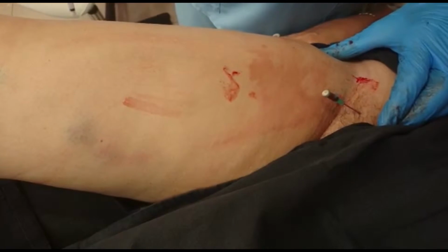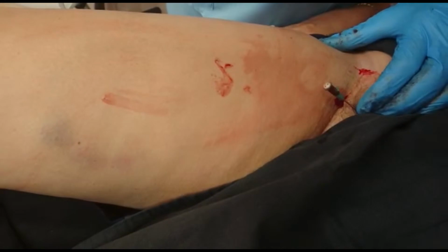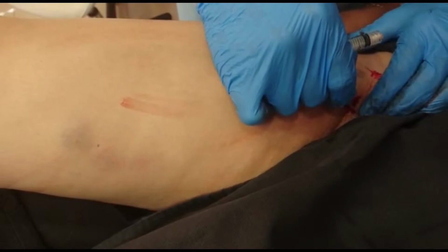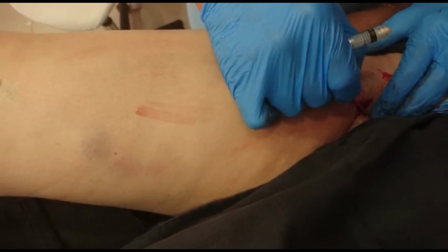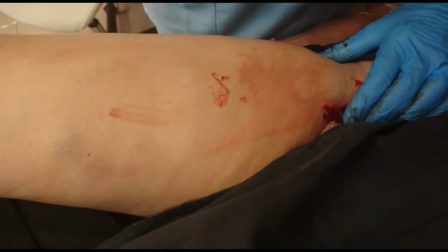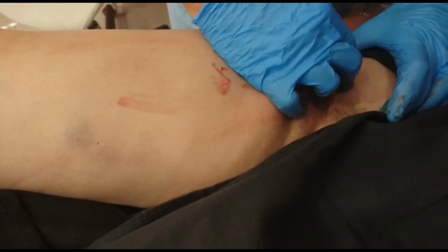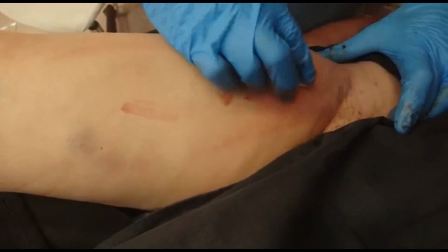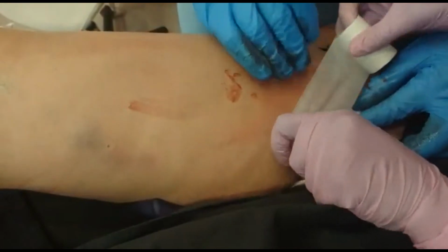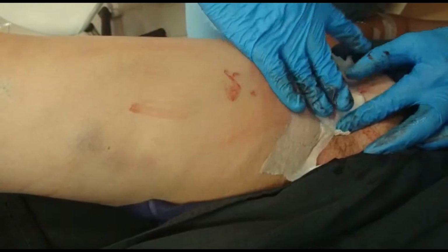If we look now, we'll see that there's a little bit of backflow, but it's definitely decreasing. We'll just keep some more pressure on there. I'm going to remove the catheter because the catheter itself can keep the area bleeding and the vessel patent. I'm removing the catheter. This will also give the sclerosant an opportunity to move in a distal direction and close the area closer to where the crossectomy took place. We will now just put a little compression on the area. That's fine.